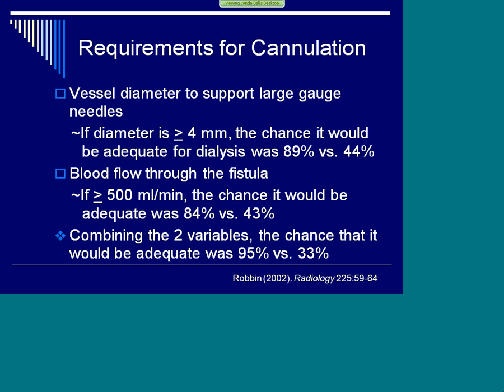We also know that we need to have at least 100 cc's more blood flowing through the fistula than whatever pump speed we are desiring or have been ordered by the physician. So in other words, if we only have a 500 blood flow through that access, we can't get any higher than a 400 blood flow, because at that point our arterial pre-pump pressures would be so negative that it would cause massive hemolysis, because we'd just be sucking so hard. And so that's why these variables have come up, and why we've got these guidelines to guide us.